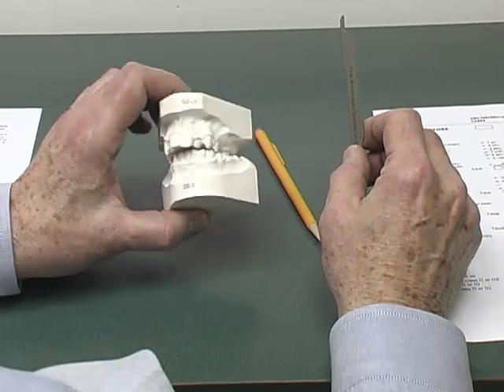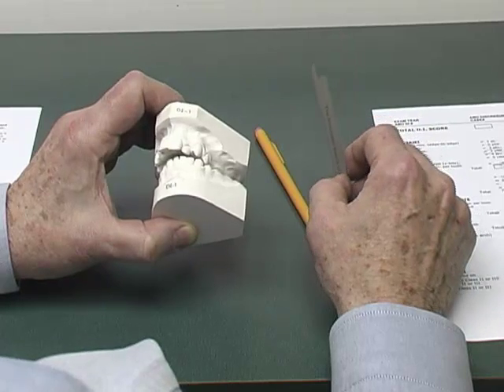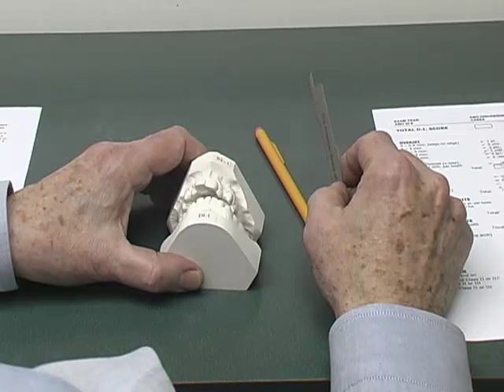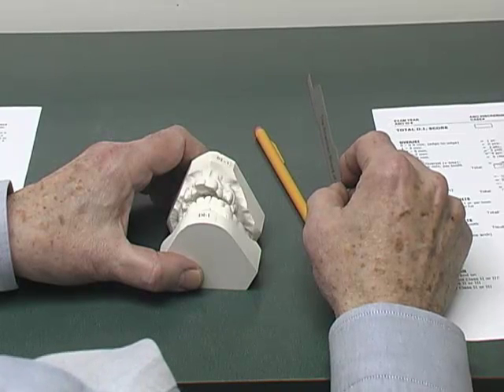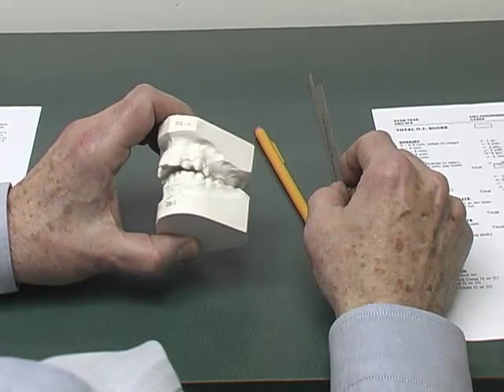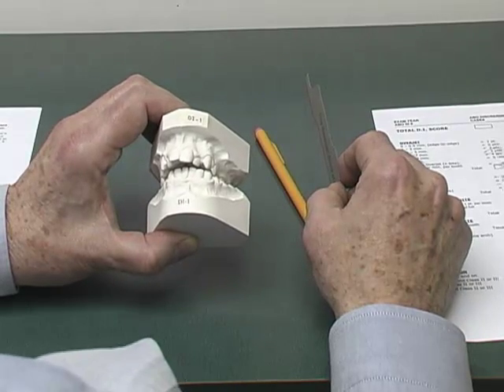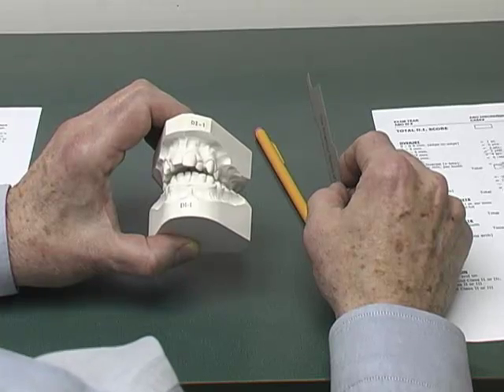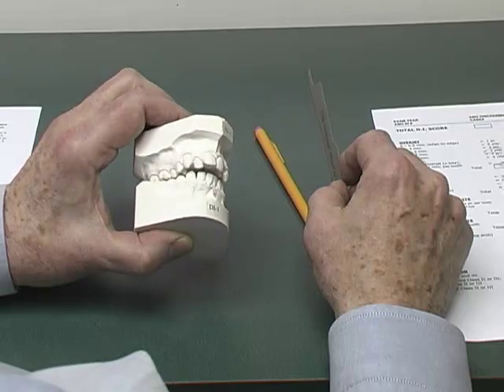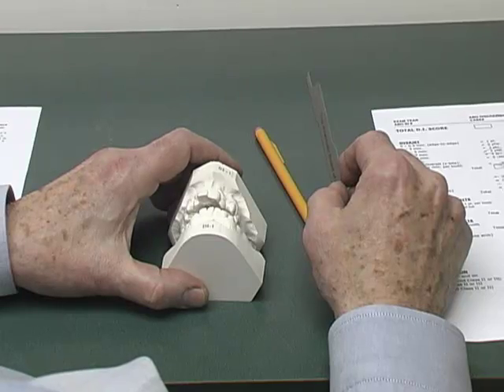I'm now going to change the casts and move to a more complex case. Remember, the DI form is measuring the complexity of cases — the number of things that are wrong — and is not intended to measure the difficulty of the case. However, this next set of casts, DI-1, present great complexity and, in my mind, a very difficult case to diagnose and to treat. So let's measure a number of categories on the DI.